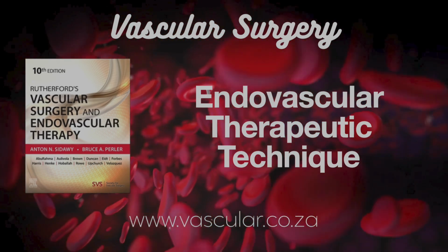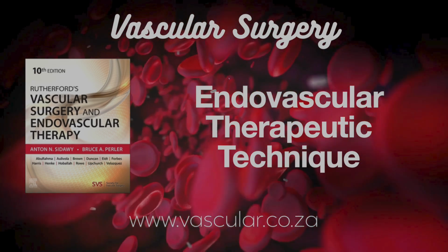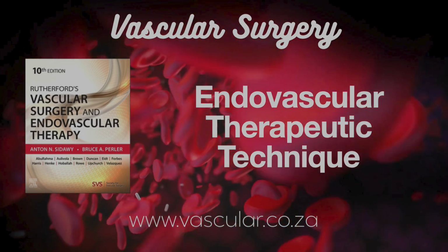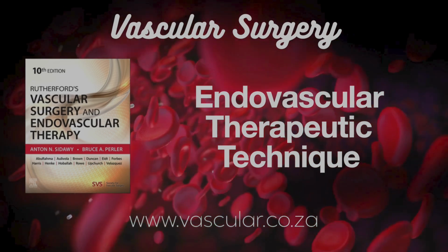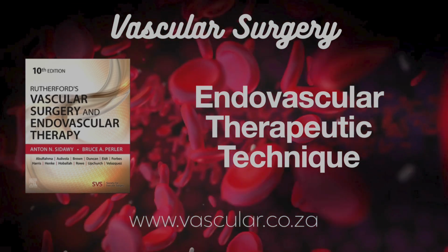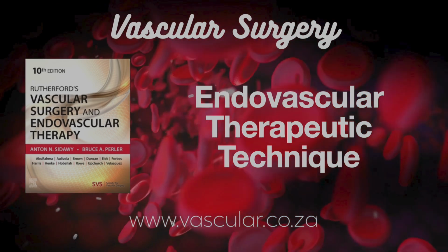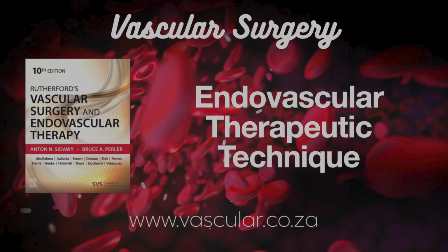Several big trials looked at these. LEVANT 1 was a key early European trial. What did it compare? It compared the Lutonix DCB, which has a low dose of paclitaxel, against standard uncoated balloons for SFA and popliteal lesions. And the results? Significant reduction in late lumen loss, the measure of re-narrowing over time, and higher primary patency rates in the DCB group at 6 and 12 months. So a clear signal of benefit from the drug.